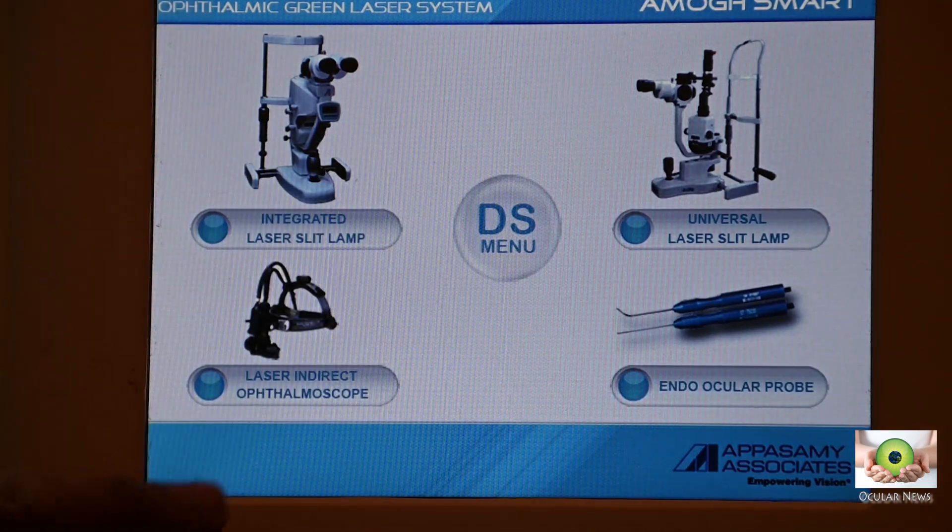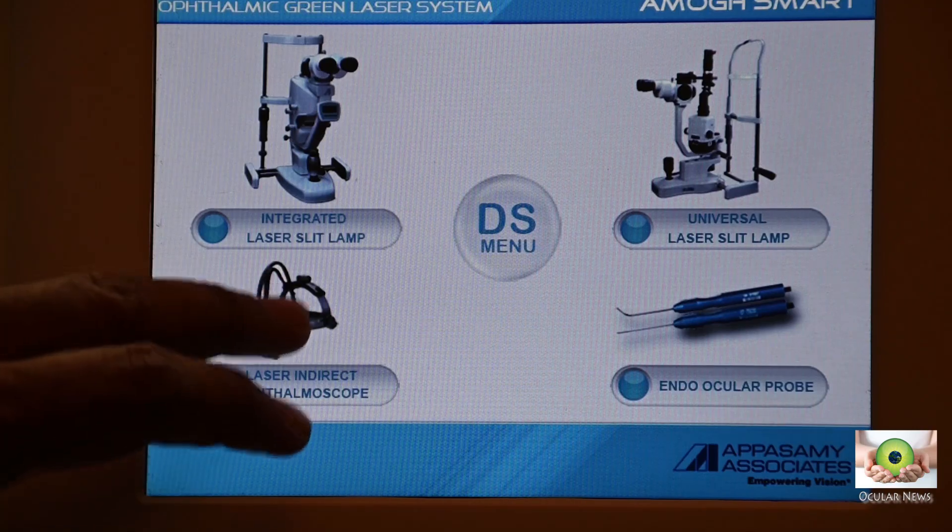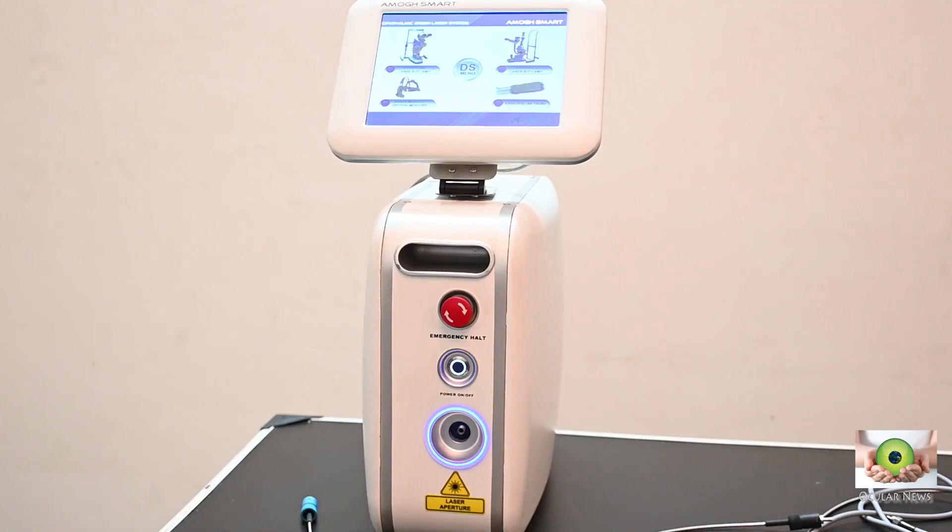We tested the laser by leaving it on for half an hour at 22 degrees centigrade, and then continuously firing for another half an hour at 400 milliwatts, 200 millisecond duration, and 100 millisecond interval. In the entire test there was no overheating, and power delivery, interval, and duration throughout the test remained spot on, which was indeed excellent.